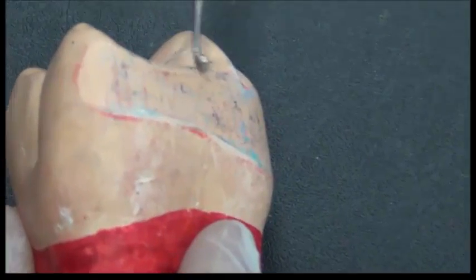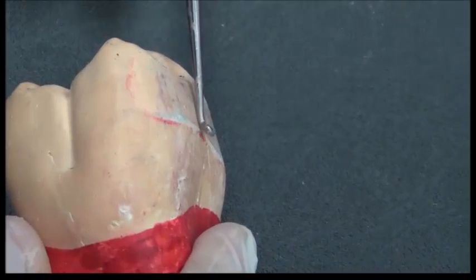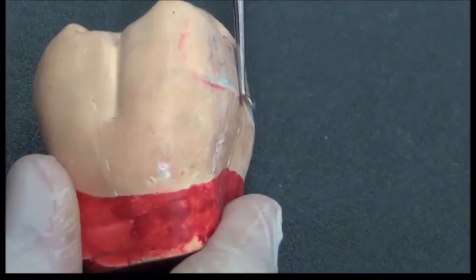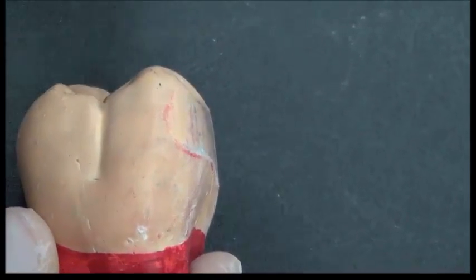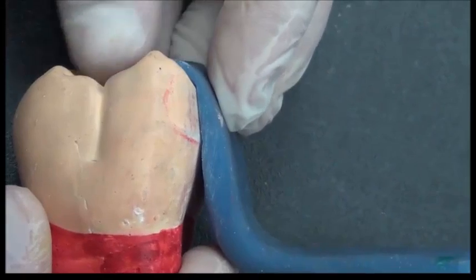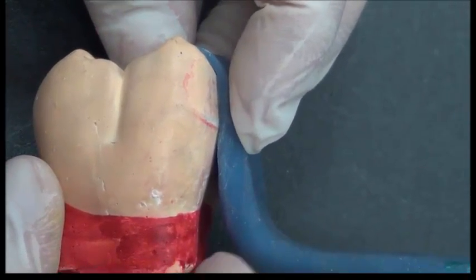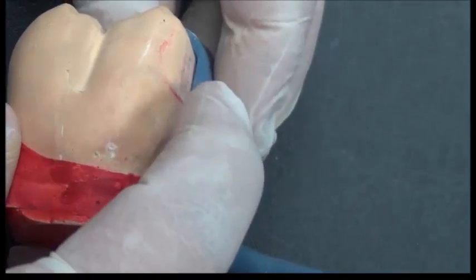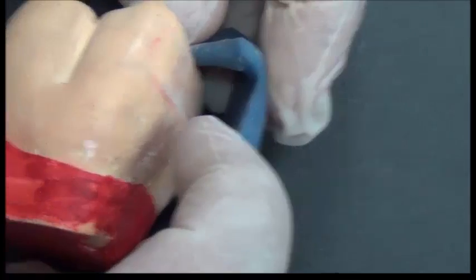As you can see, this area is now flat, and it allows to have one direction for the insertion and removal. You can see it more clearly if I take this representing the rest, the guide plane, and the rest of the metal components. So we call this the guide plane on the tooth.